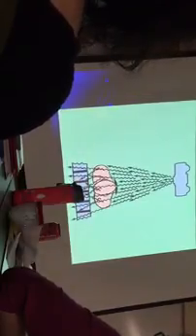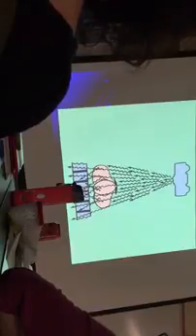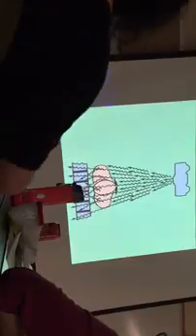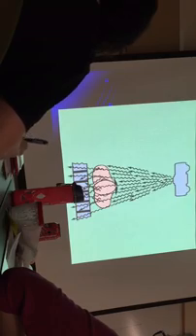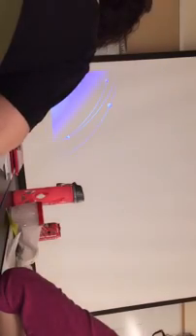Right, so that's the purpose of it, to clean up some of this scatter radiation that otherwise, if you leave it alone, if you don't do anything, it doesn't matter how much collimation you have or how thin the patient is, you're going to have scatter radiation. Okay? And so that's why the grids.